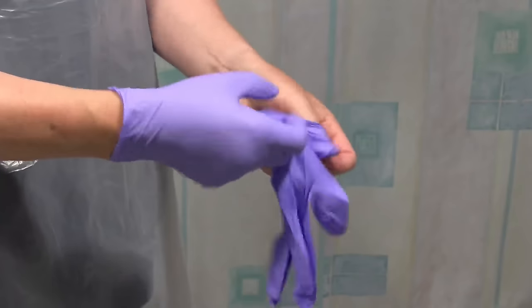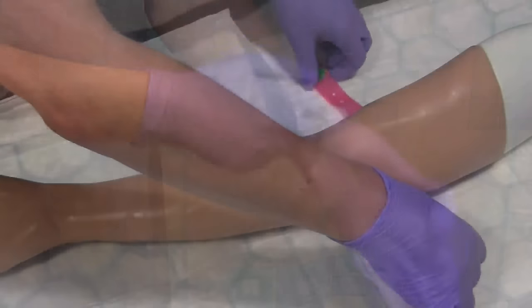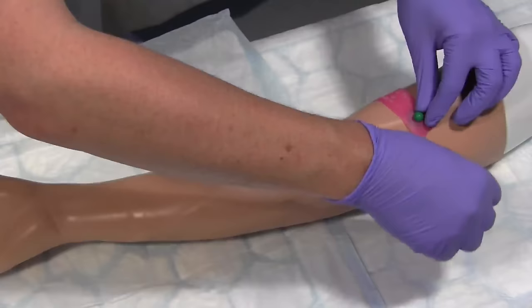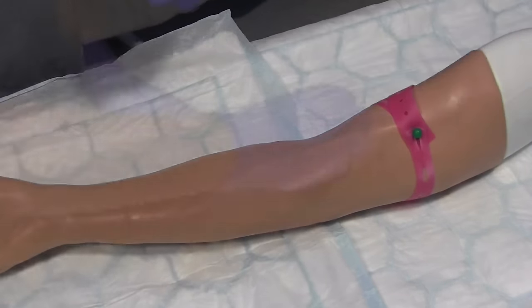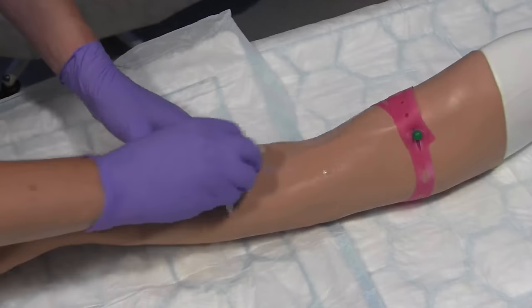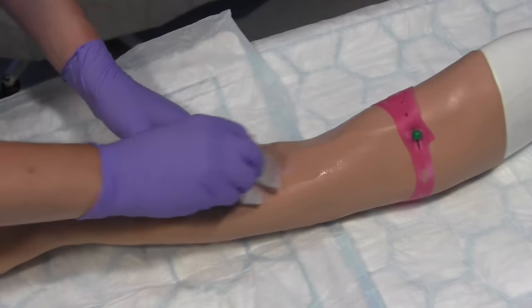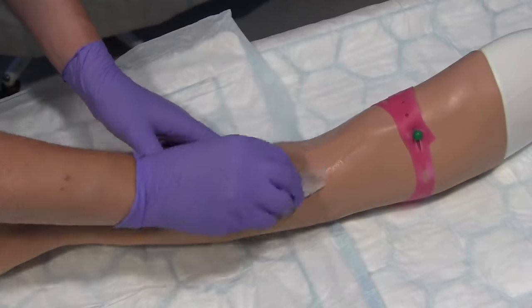Wash your hands and put on your gloves. Reapply the tourniquet. Clean the site vigorously using a crosshatch motion for 30 seconds and then leave it to dry for a further 30 seconds.